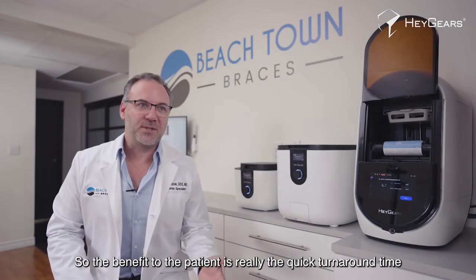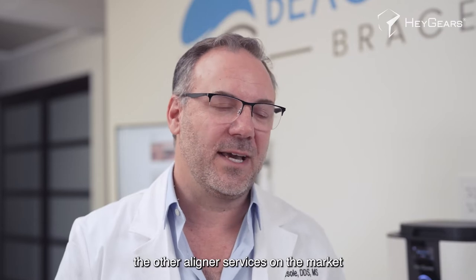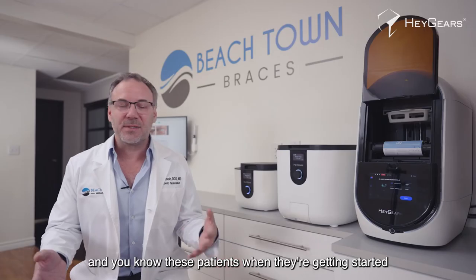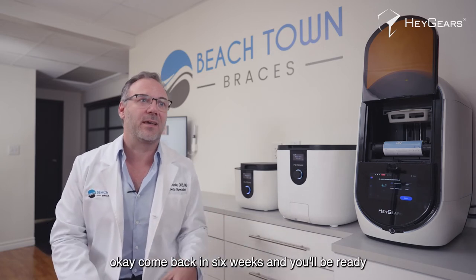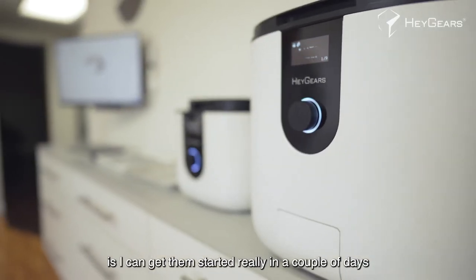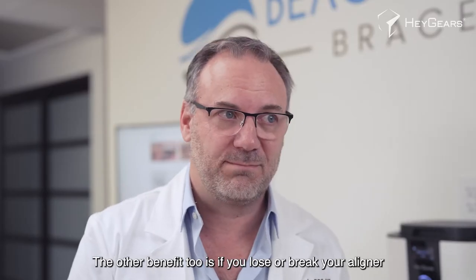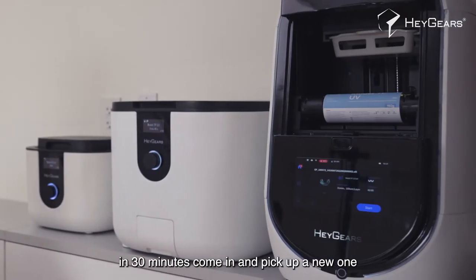The benefit to the patient is really the quick turnaround time. Typically when you send out to other aligner services on the market, it can take up to six weeks to get an aligner, and these patients when they get started are really excited. You don't want to say 'come back in six weeks and you'll be ready.' With HeyGears printing in-house, I can get them started in a couple of days. And if you lose or break your aligner, just give us a call and in 30 minutes come in and pick up a new one.